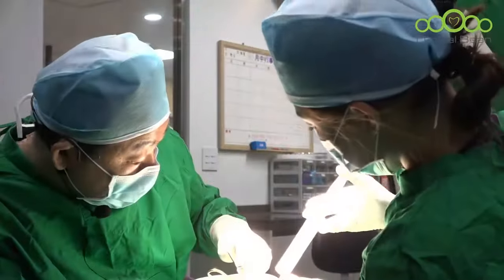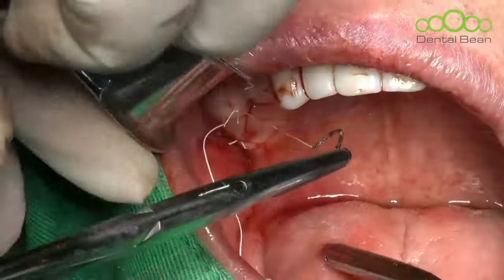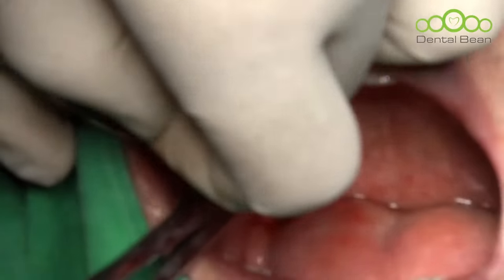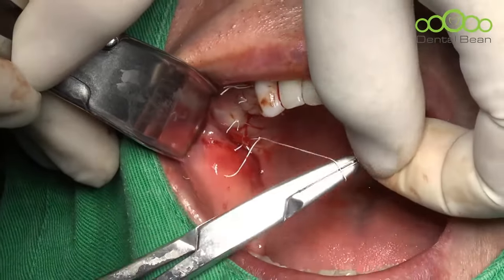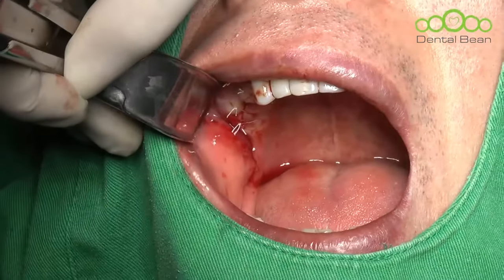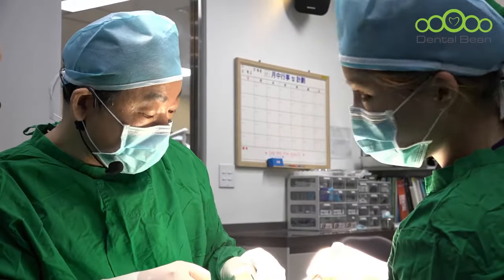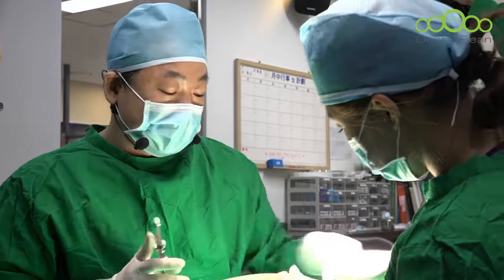One more here. For sure, here I'll make one more. Hold on. Too short. Possible. Okay. Let's finish the right side. Irrigation. Okay, it was done like this. I'll add more anesthesia on the left side.